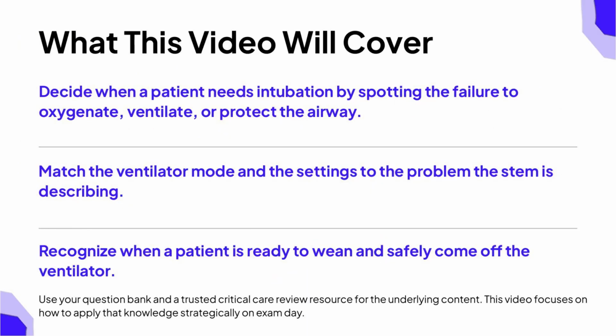First, we will learn to recognize when a patient actually needs to be intubated by spotting the failure to oxygenate, the failure to ventilate, or the failure to protect the airway. Second, we will sort out the ventilator modes you need to know, which are assist control, synchronized intermittent mandatory ventilation, and pressure support.